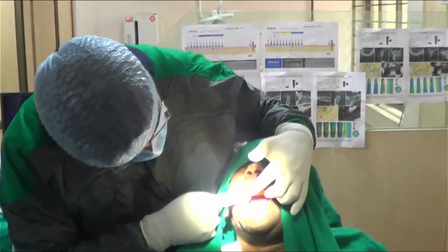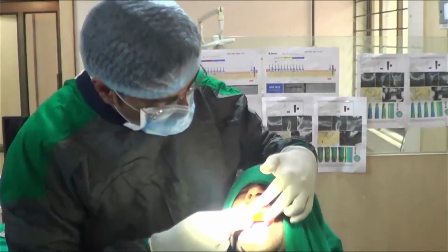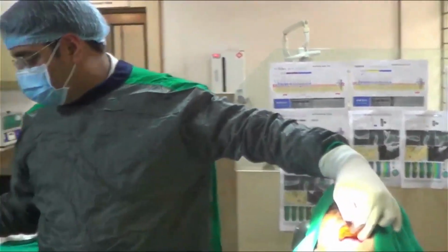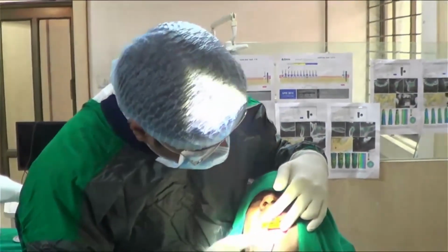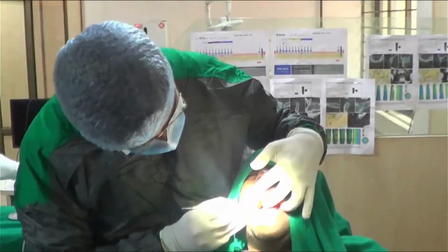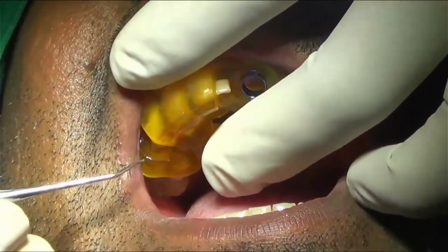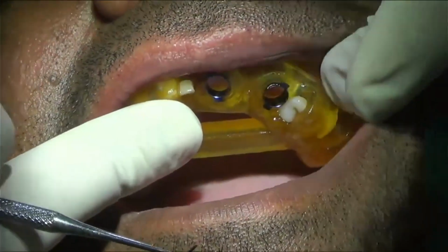The first and foremost thing that we do is check the fitting of the surgical guide. How are we checking the fitting of the surgical guide? Through these windows which have been given. You can see that there is no gap between the tooth and my surgical guide material, so it is perfectly fitting well. So one, we need to check it through the window which has been given.